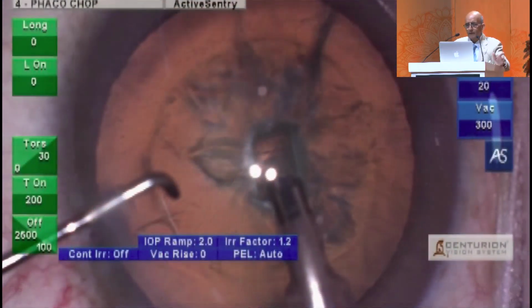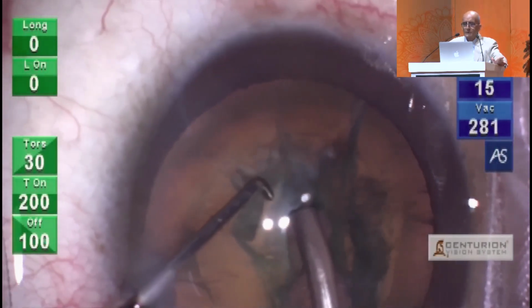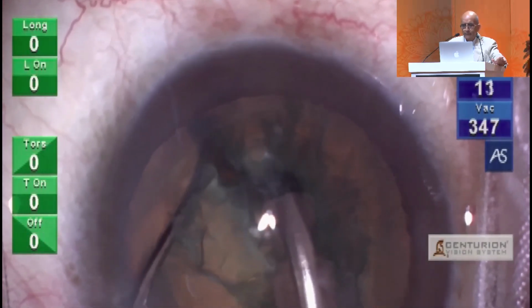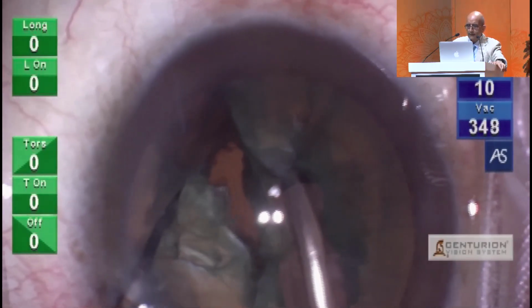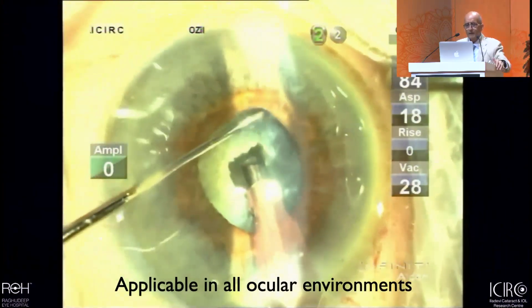And you can have different examples with the different grades of cataract. Whatever maneuver, go in a step-by-step manner. Do not aim one stroke. These cataracts are very dense. They look okay when you see the red glow, but they are really quite leathery and tough. So you go through all that. You can do that in a small pupil.